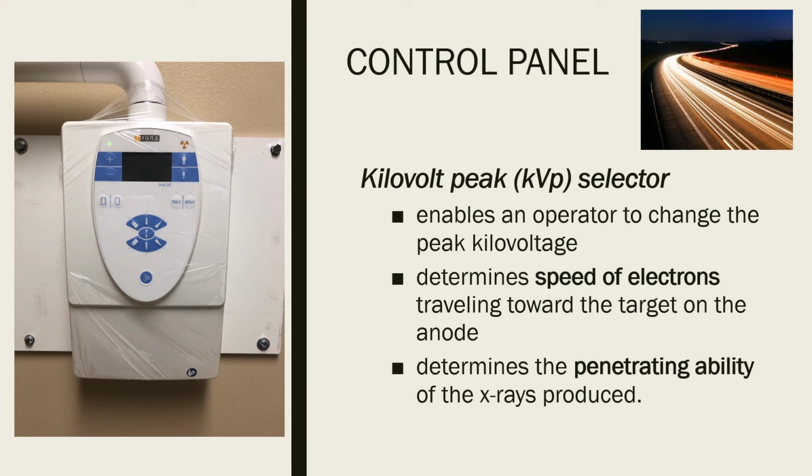On newer X-ray machines, kilovolt peak selector comes in form of icons of a small, medium, or large patient because kilovolt peak is linked to the penetration of large or small patient. When the size of the patient is changed, the X-ray unit itself adjusts the milliamperage to maintain the film density.